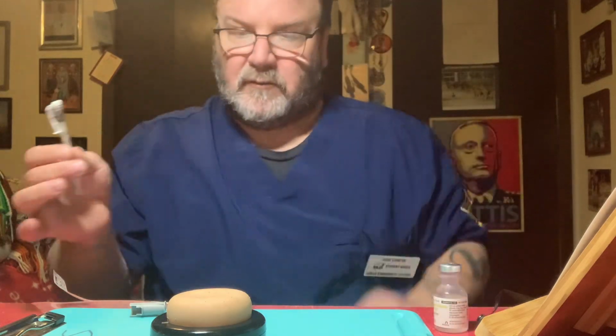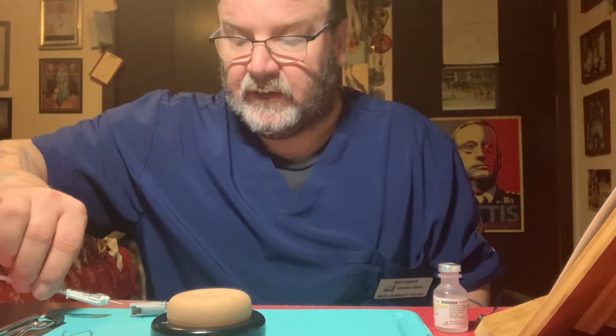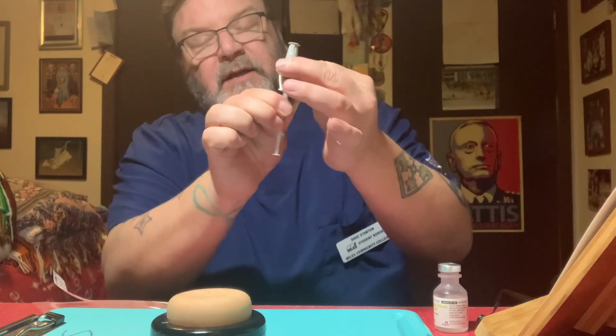Bubbles. 0.1. Okay, if I was going to take this to the patient's room, I would recap it using the one-hand scoop method, grasping at the base of it for safety. And once I got to the patient's room, I would check the patient's ID band, have him verbalize his name and date of birth. Skip Rocker, 1/1 of 1972.